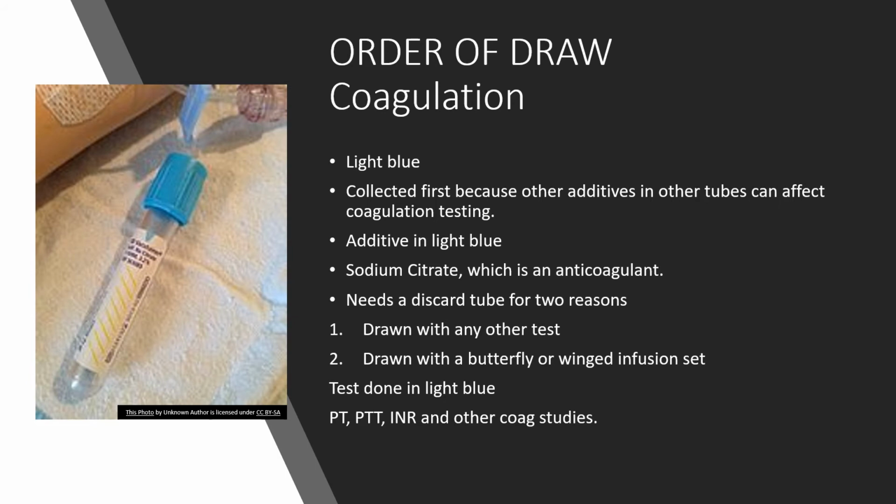Okay? So if you're drawing a blue top tube and it is ordered with any other test, then we must draw a discard tube first. And that would be a red top tube, right? The other reason would be if we're drawing with a butterfly or a winged infusion set. That's just another name for a butterfly.